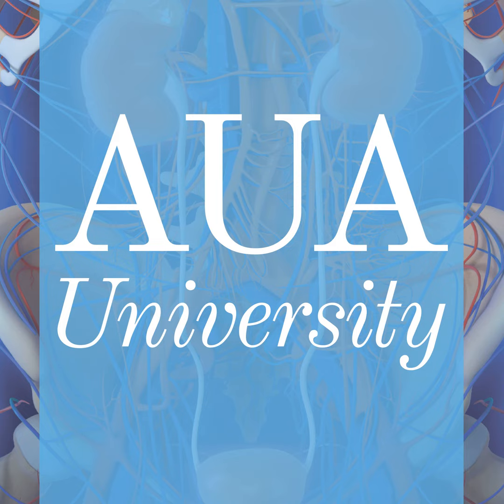I completely agree. If they were considering radiation, most times the radiation oncologist would want that node biopsied to determine whether they would increase the field. So I guess this is an important information. So first, advise your patient about the potential result of the PSMA PET CT scan and that you might detect a solitary lesion or maybe an oligometastatic disease.